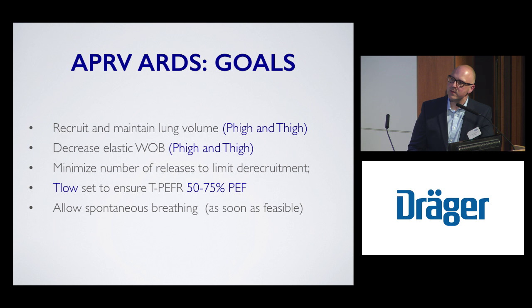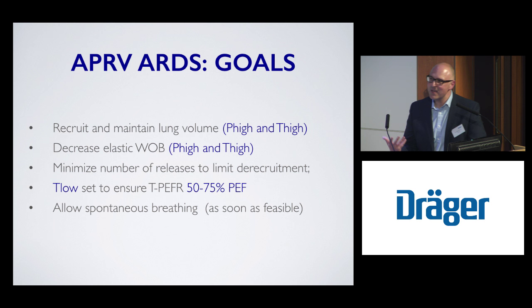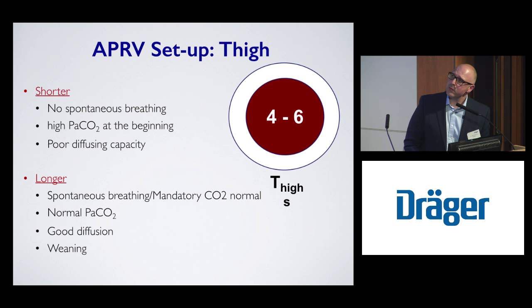And then I just say here, allow spontaneous breathing as soon as feasible. I'm not really committing myself to say exactly when, but I think when the patient is ready. In other words, when the patient is improving. And the reason why ready is that we need to see some improvement in lung volume. I can't tell you two days, 3 days, but clearly it's not feasible to start spontaneous breathing in someone who is really struggling with the high driving pressure. Okay, so we've got some guidance.